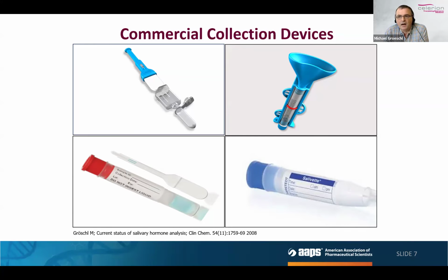Therefore, before starting a study, you should consider which collection system would suit best for the analyte you want to test. A major factor is whether the system could hinder or falsify the analysis, or whether, especially with adsorption modules, the analyte can be completely recovered during the sample processing.